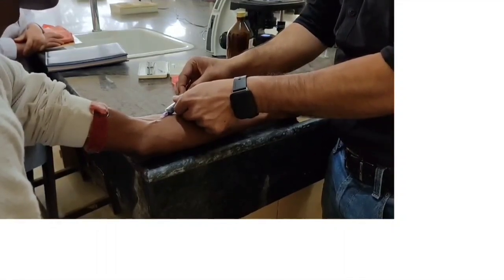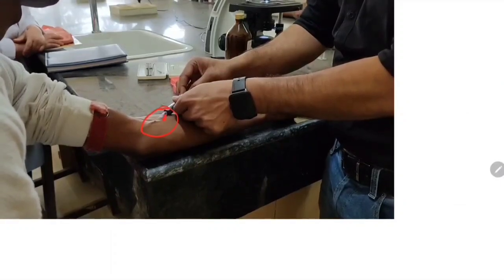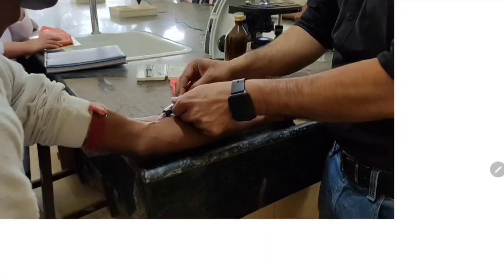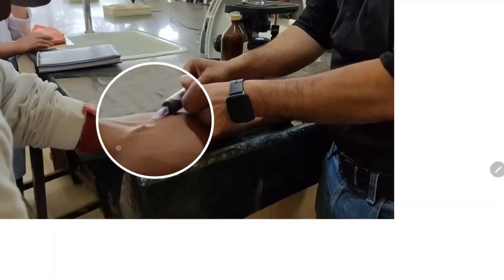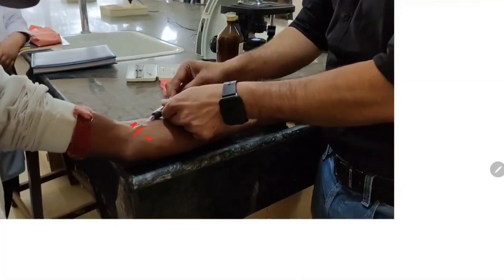Yeah, blood is coming. You can see here, this area, this blood is coming. And all the superficial prominent veins, we can see this is a prominent vein.